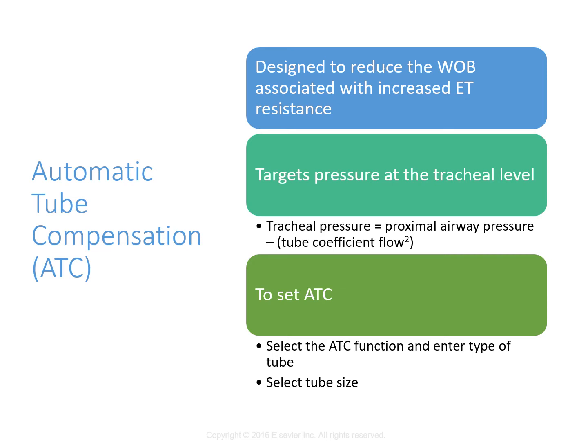But we know that that's a fixed pressure, and pressure support ventilation really doesn't as accurately compensate for the variable flow through the ET tube, because inspiratory flow of the patient can vary from breath to breath, right? Do you take the same volume of breath right now that you took 2 seconds ago? Variable flow is just a normal thing. And so that pressure support doesn't account for that.